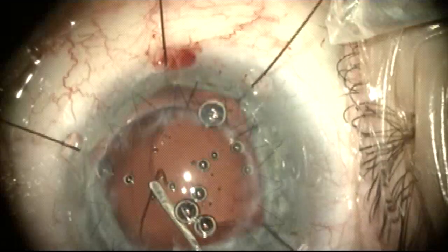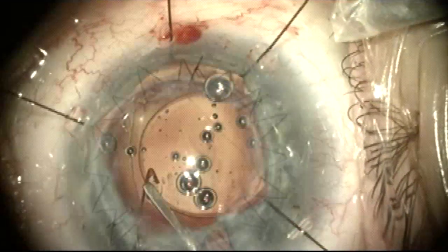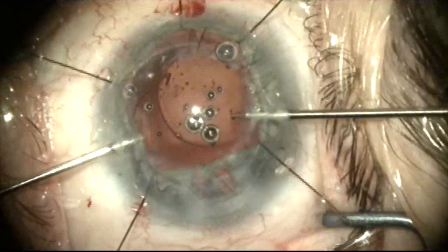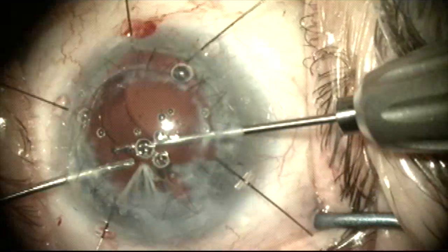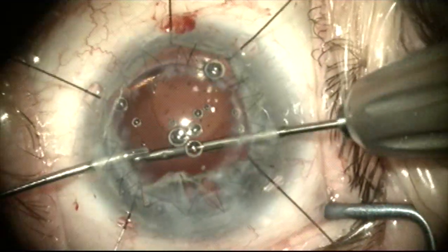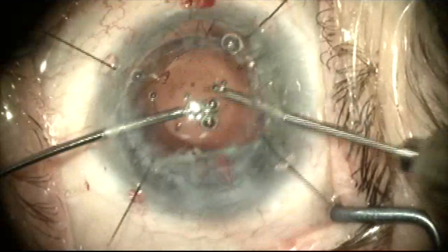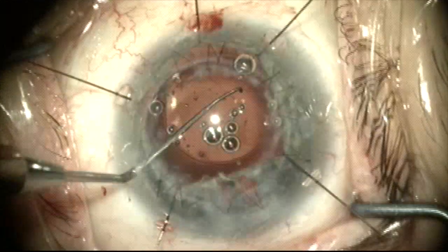I'm trying to put very little downward pressure on the lens here and just sort of sneak it into the recess of the capsule bag. Once this is done I'm going to use a pair of micro forceps to perform a handshake technique, grab the trailing haptic and tuck it under the anterior capsule in the capsule bag. Now both haptics are located in the capsule bag but away from where the radial tear in the capsule is.